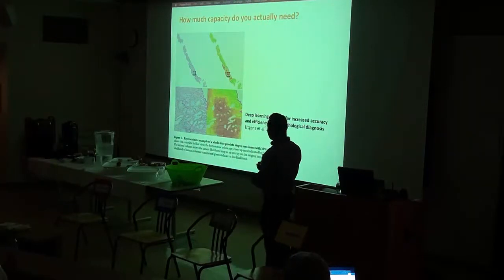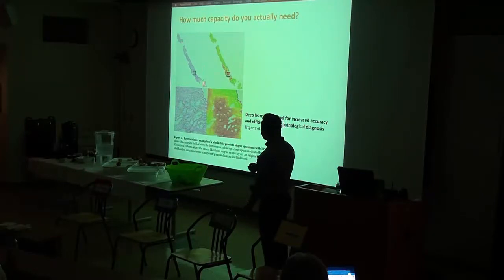And here they are showing us a deep learning tool to detect cancer. This is the original histology here, and this is the color-coded prediction. These areas in red are the areas that are predicted to have cancer. And for this particular example, it says here that this area corresponds to 30% of the specimen.